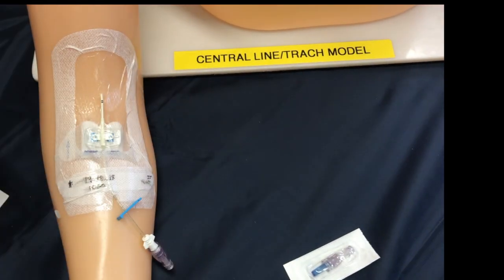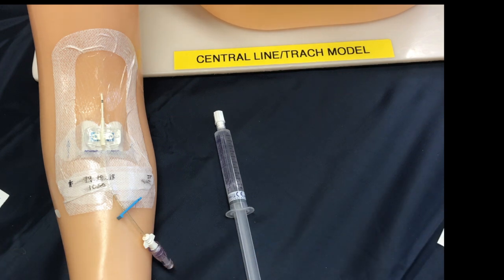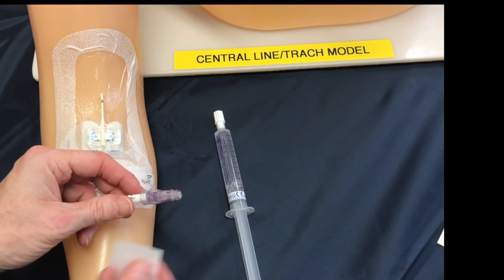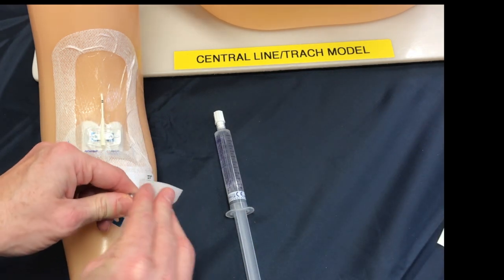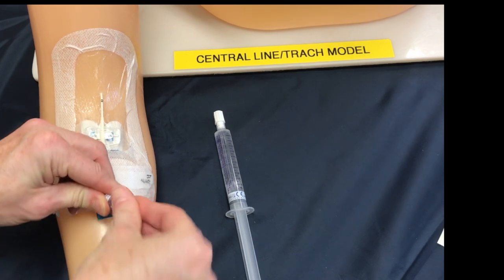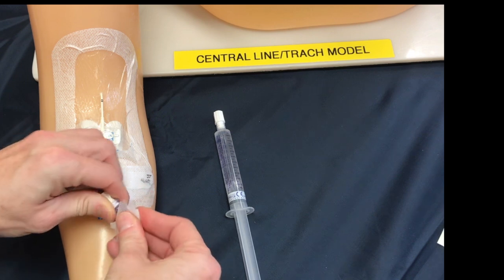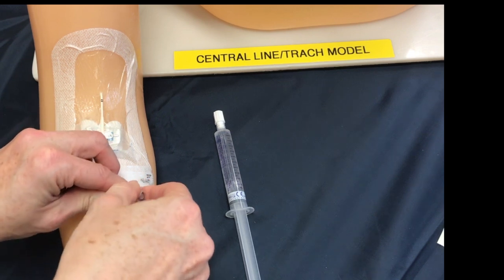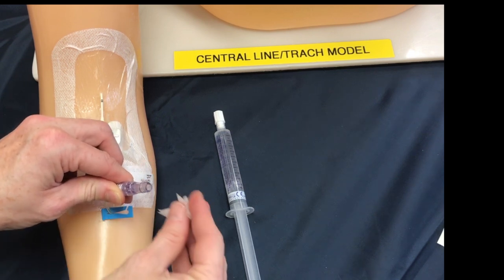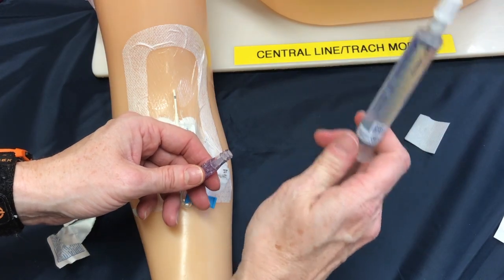We're just going to prepare our saline here. Every time we access a PICC line we need to cleanse it with an alcohol swab or chlorhexidine swab for at least 15 seconds. This is to help prevent the introduction of microbes into the bloodstream. Don't forget to use some friction and to really get around that entire hub to make sure it is clean to prevent any contamination. We'll let this air dry.